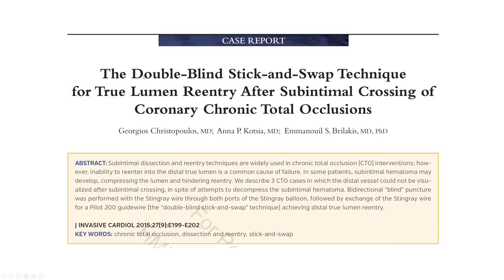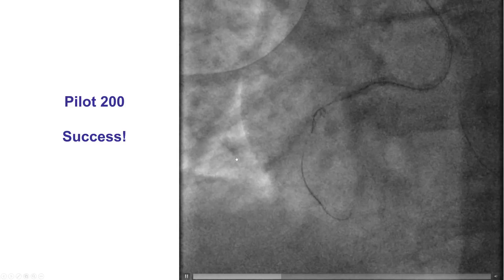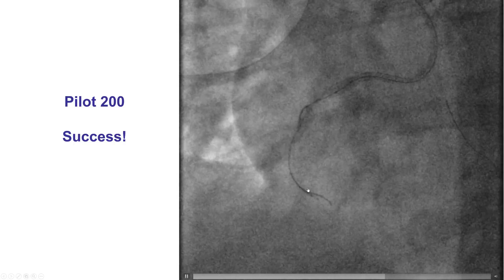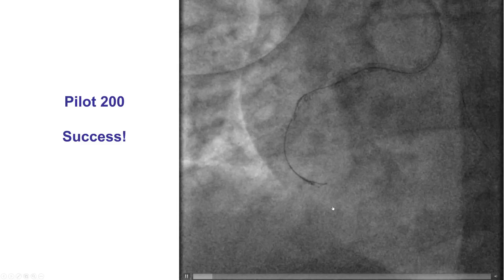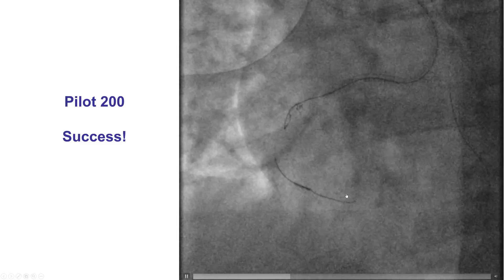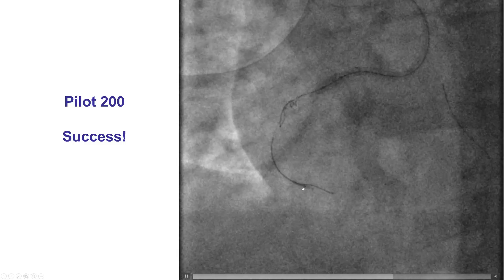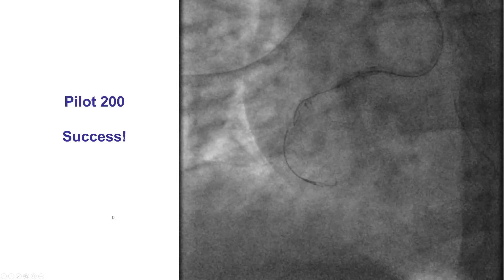A variation is the double-blind stick-and-swap technique, in which the wire is advanced on both sides of the Stingray balloon until the true lumen is selected. The wire is advanced over the area that doesn't face the distal true lumen, is withdrawn, advanced again, and eventually the true lumen is selected. Going proximal to the proximal marker, the wire is advanced, eventually finding entry into the distal true lumen.